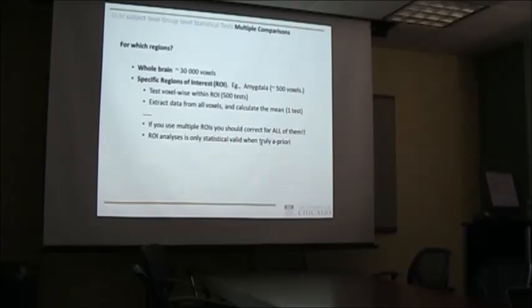Say you would find a bunch of regions based on the test you're running now, patient group A versus patient group B. You then find a bunch of clusters, you extract them, and then start to, say, correlate with symptom severity. The test is not really independent anymore because you already selected stuff that has a stronger activation in your patient group to begin with.